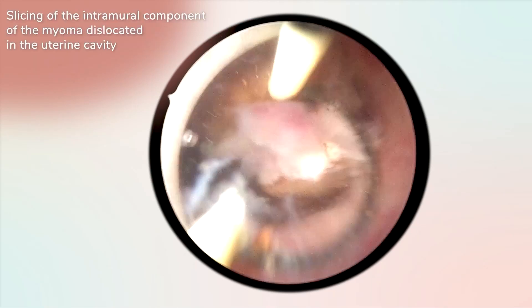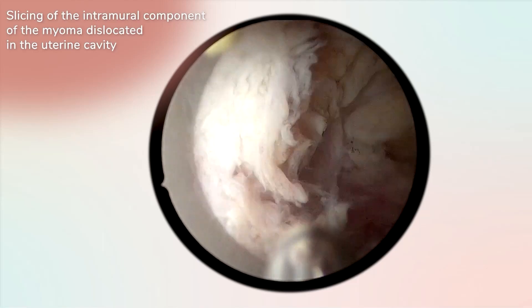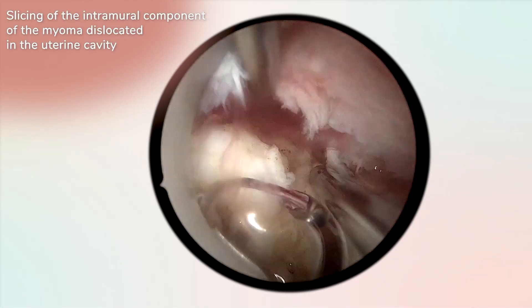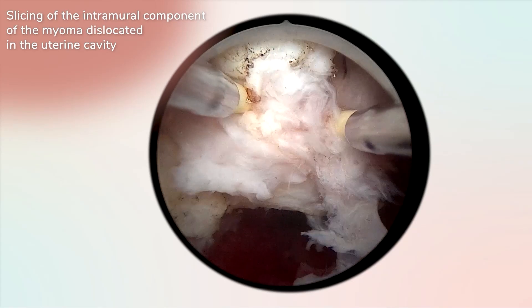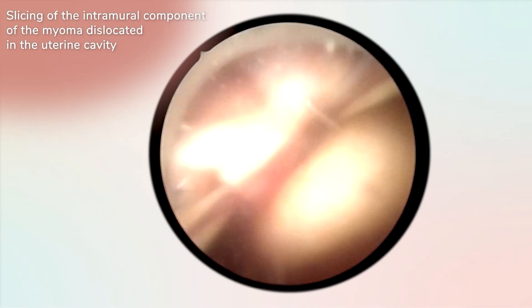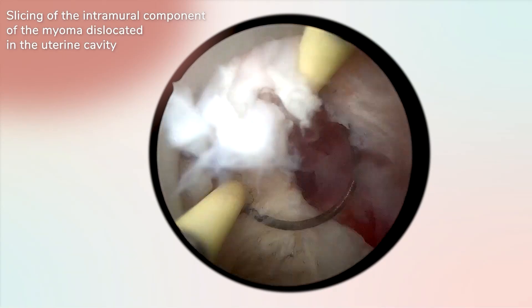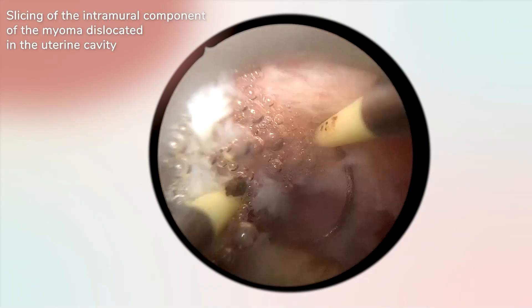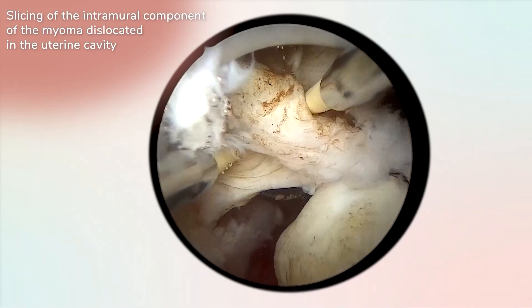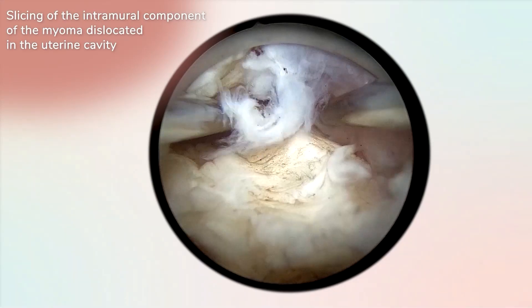Freed from the fibro-connective bridges and under the myometrial contractions, the intramural component of the myoma is now partially dislocated into the uterine cavity, allowing for its removal through classical slicing. Care must be taken to move the electrical loop from the notch of the myoma toward the uterine cavity to avoid dangerous complications such as uterine perforation. In the case of submucous myomas with a prevalent component developed in the myometrium, as for type 2 or type 3 myomas, it may be useful to alternate between blunt dissection using the cold loop and slicing the intramural component that has been displaced into the uterine cavity.